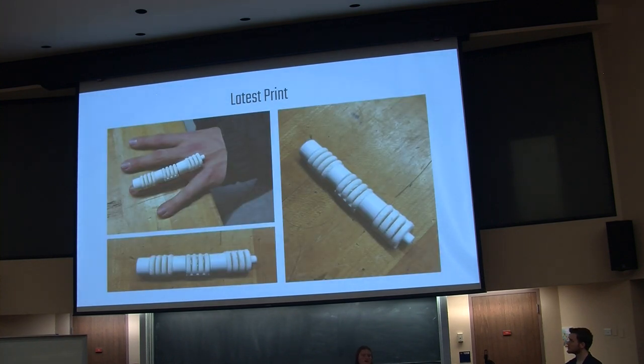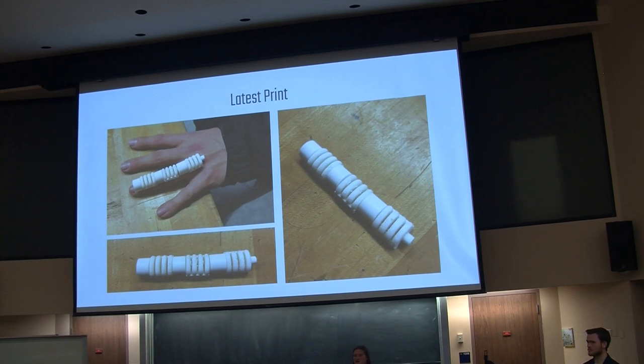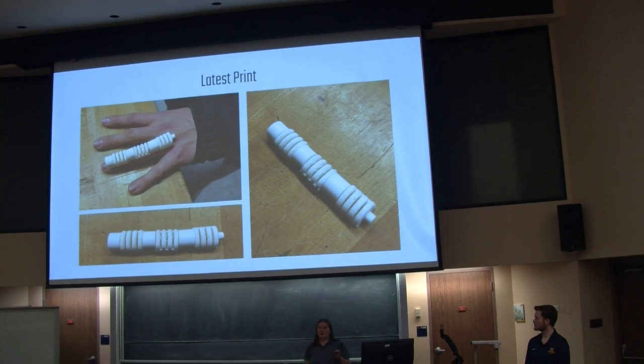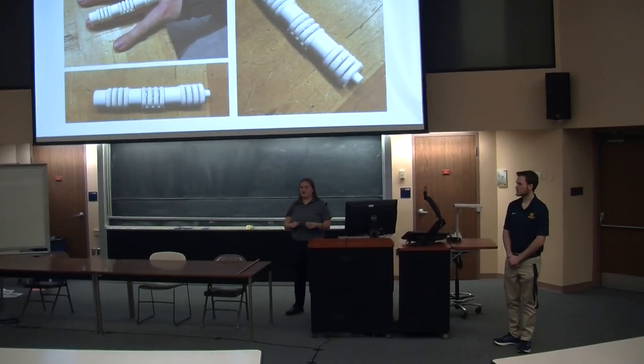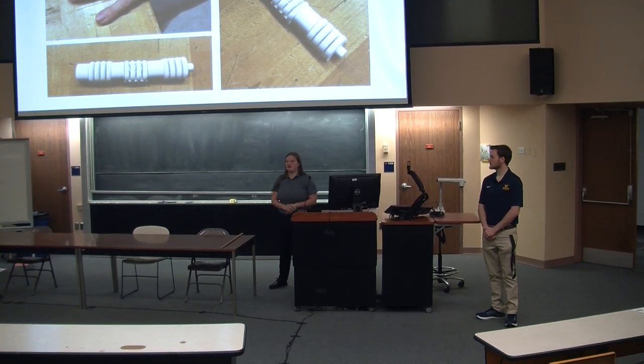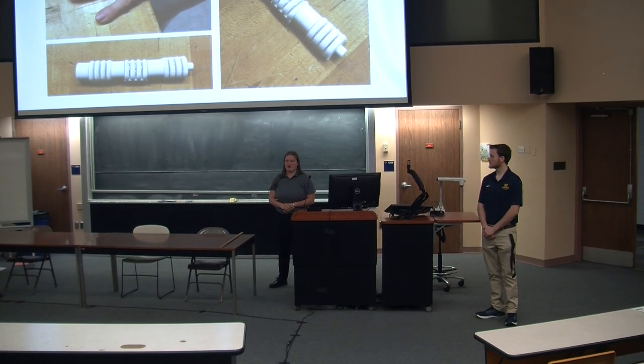So here's the latest print that we did. We redesigned those connectors so they're much thicker and more likely to be able to hold the air and transport it between each actuator. We're currently redesigning the actuators because when it printed, the support material was really difficult to get out, considering that the opening for those tabs on the end are very, very small — about one to two millimeters wide. So it's very difficult to even get tweezers inside of there, and we're taking that into consideration for our next redesign.